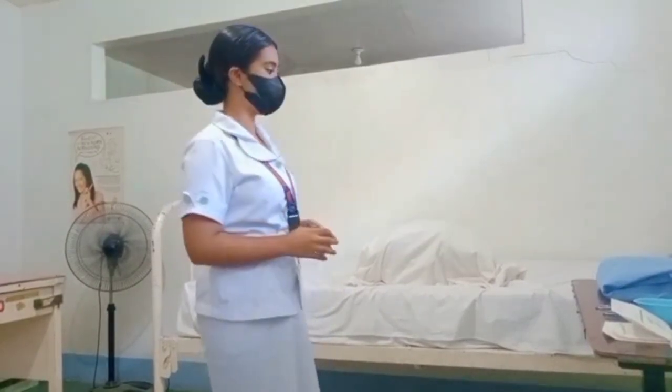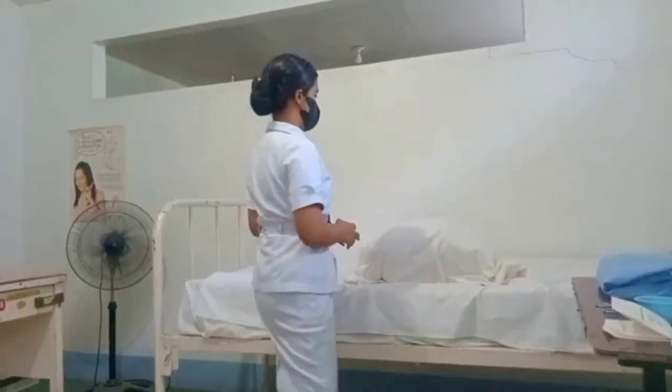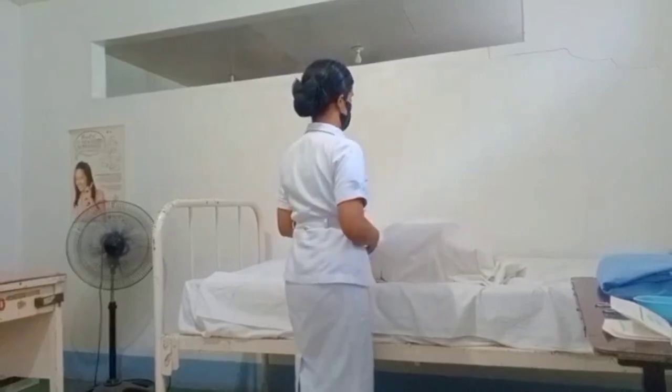Good day, ma'am. For today's video, I am going to assess a catheterization. So first, I am going to assess the client. So ma'am, do you feel any pain po?